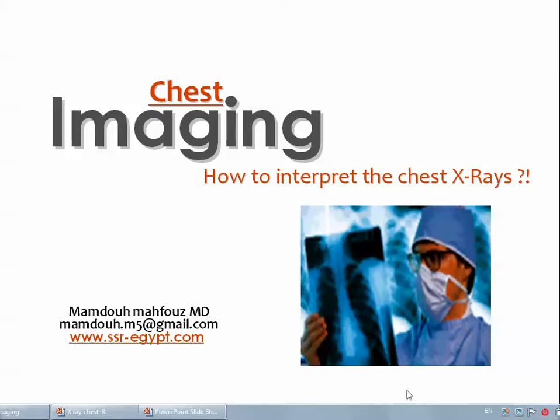Dear colleagues, we are going now to start a new series of lectures in a separate topic, which is chest imaging. Actually, we have finished about 9 lectures in the issue of brain imaging. Still, there are a lot of things to be covered in this particular domain, but actually I am preparing now some of the new lectures, and also some of the lectures are already present, but they will be projected in the sector of pediatric radiology.